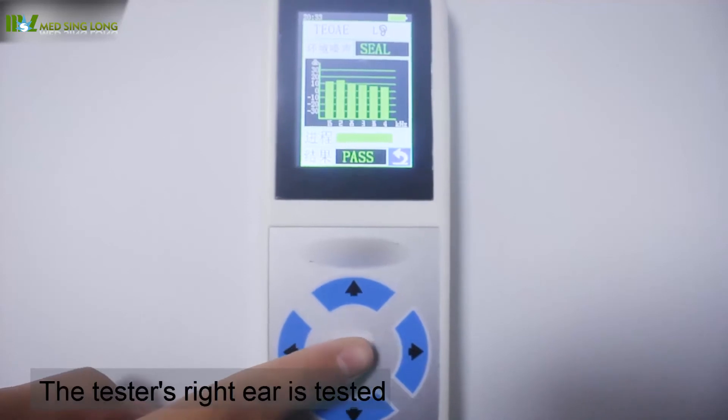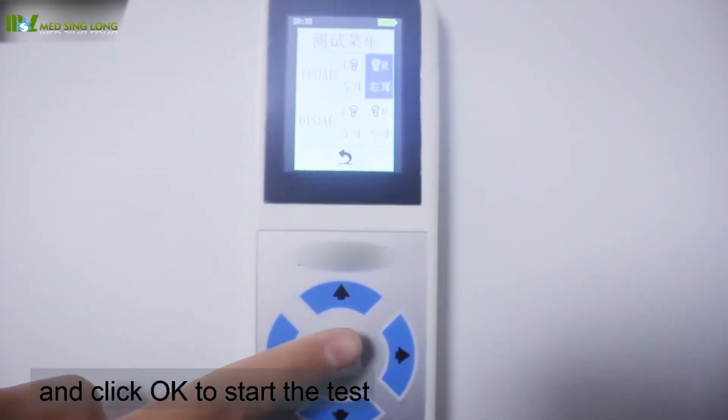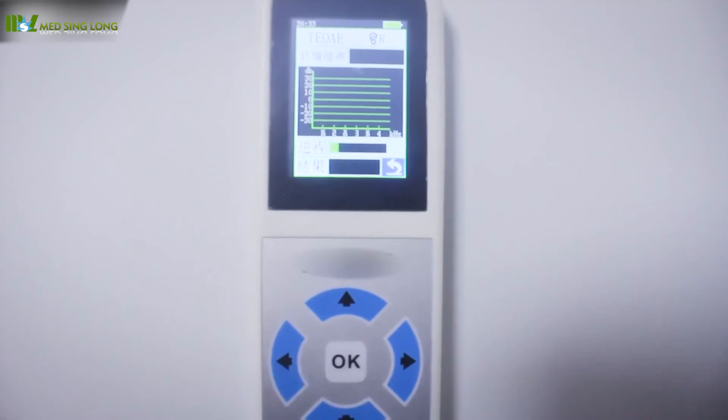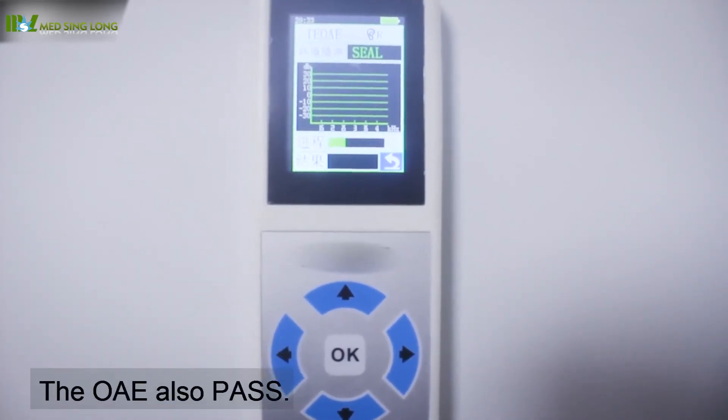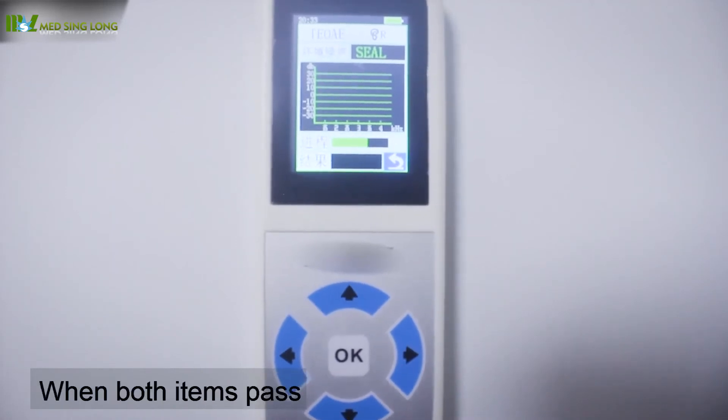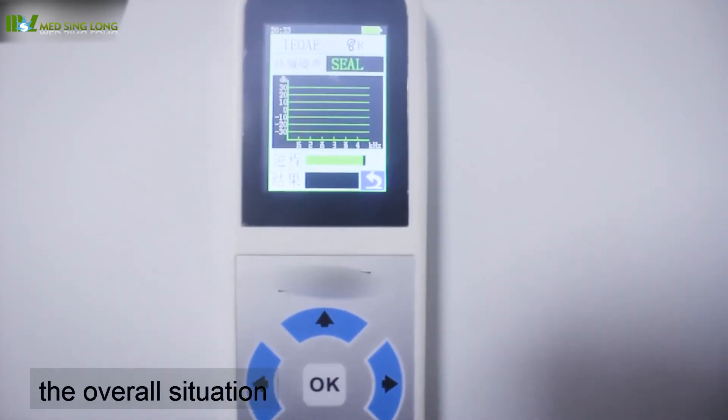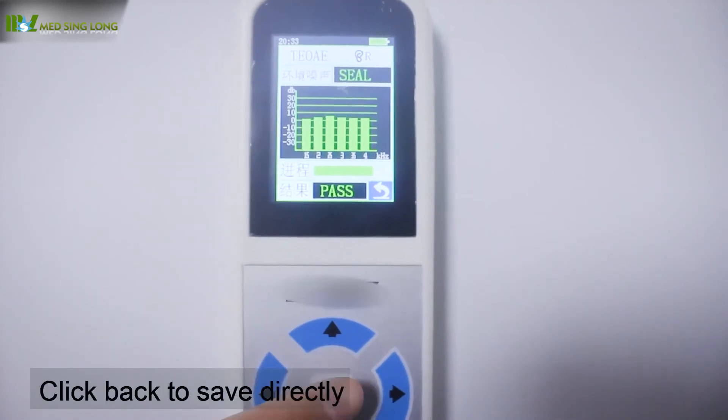The tester's right ear is tested. Click OK to start the test. Ambient noise display passes. When both items pass, the overall situation will be displayed. Click back to save directly.